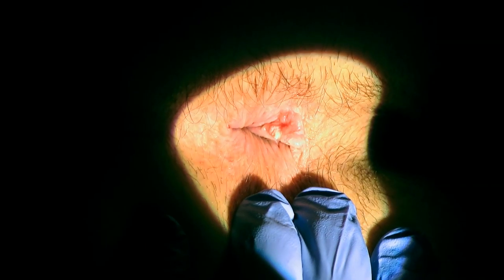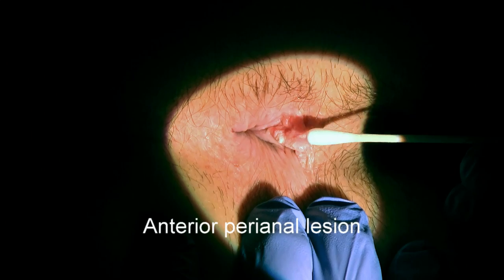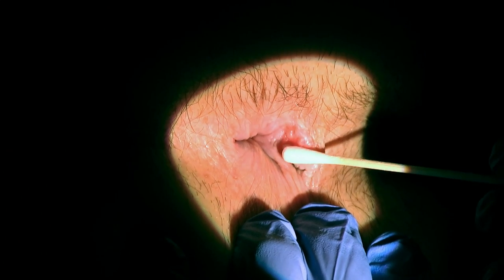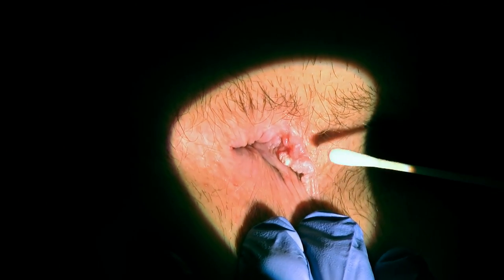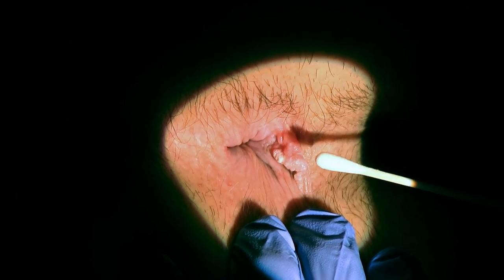This gentleman has a perianal lesion — an anterior perianal lesion visible in this area, typically like a wart. The concern raised last time was a bit of ulceration at the base of the wart. Perianal warts are most commonly due to HPV type 6 and 11; however, co-infection with more oncogenic types is possible.